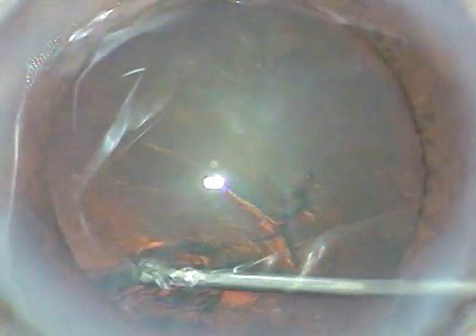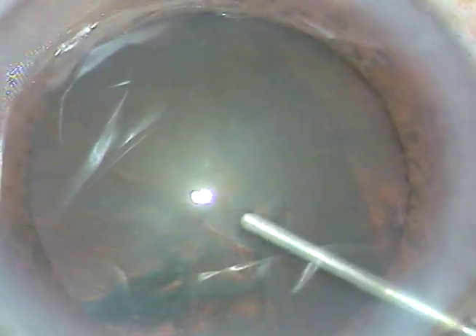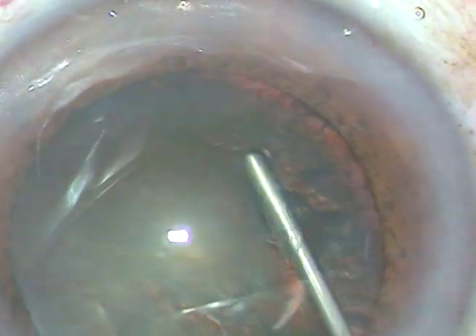Now, hydrodissection. The fluid wave should go to the opposite equator. Tap the nucleus, and the fluid should come along the equator anteriorly. Now rotate the nucleus.